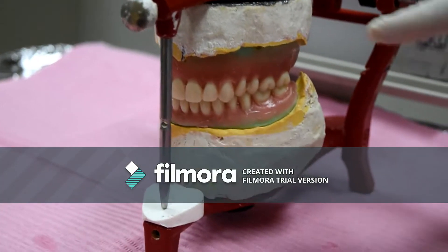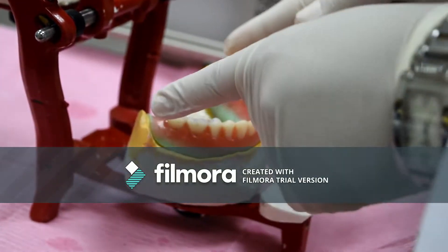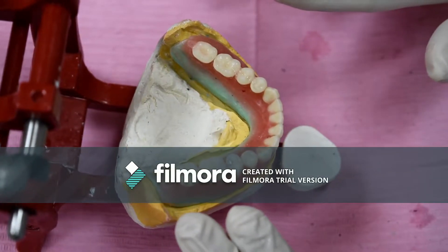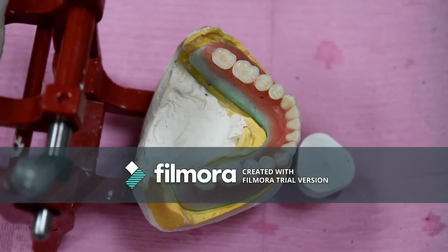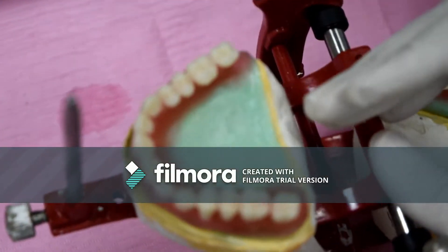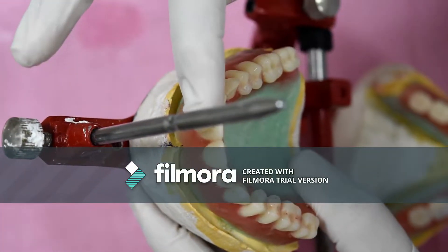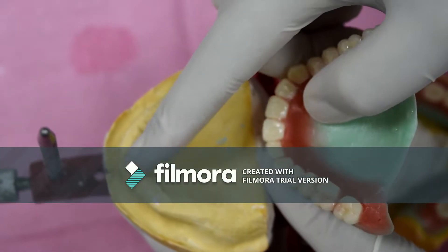Maximum intercuspation should be present between the posterior teeth as well. Regarding the lower arch, the central groove should be on the crest of the lower ridge to ensure stability of the lower denture, and the lower posterior teeth shouldn't be inclined lingually, otherwise it will encroach on the tongue space. Regarding the upper arch, the midline of the dental arch should coincide with the line drawn from the median palatine suture, the incisive papilla, and the labial frenum. Also, the labial surface of the central incisors should be 8–10 mm from the center of the incisive papilla.